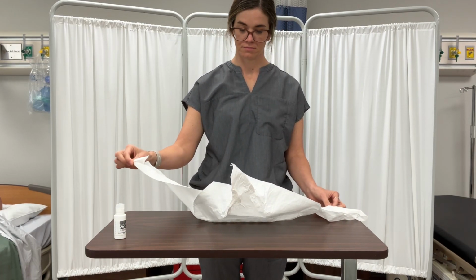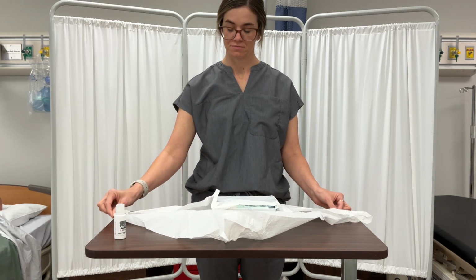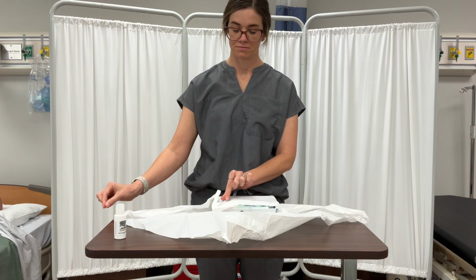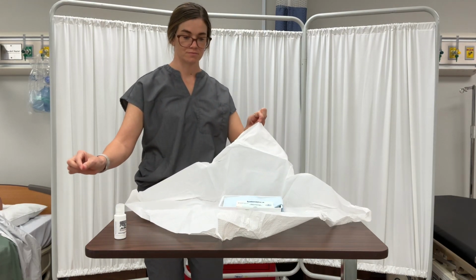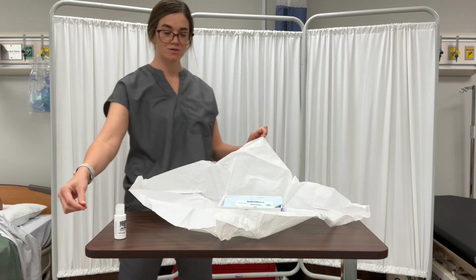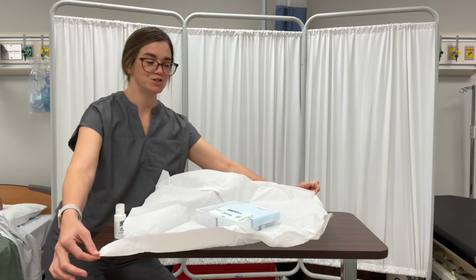And then the third, she'll grasp the outside border of the last innermost flap and stand away from the sterile package and pull the flap back, allowing it to fall flat on the table. Okay, and I also, at this point, like to turn my stuff because I am all about straight things.